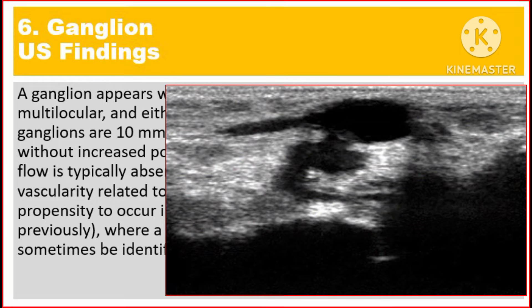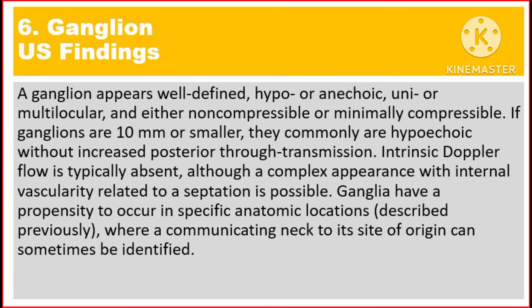If ganglions are 10 mm or smaller, they commonly are hypoechoic without increased posterior through-transmission. Intrinsic Doppler flow is typically absent, although a complex appearance with internal vascularity related to septation is possible.